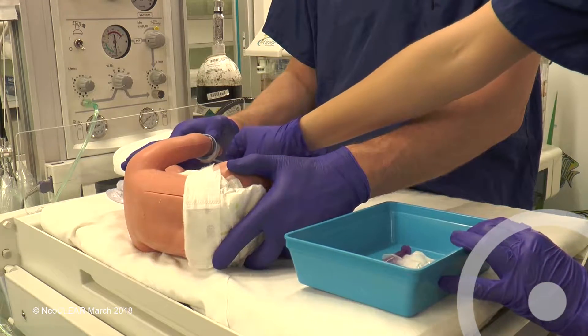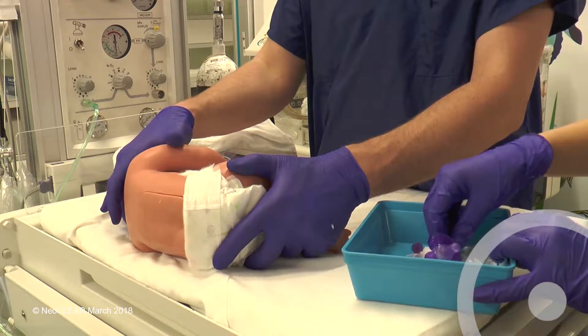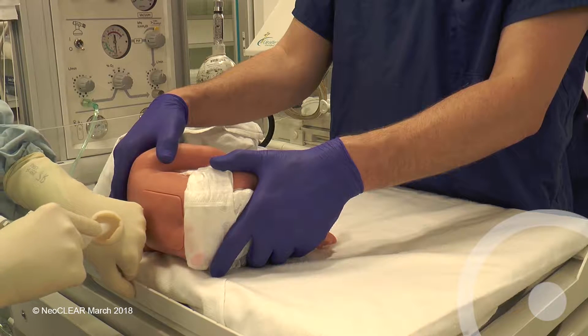The infant may be given a few drops of milk or sucrose solution before the procedure and again during the LP if needed. The second assistant should begin timing at the start of cleaning the skin.